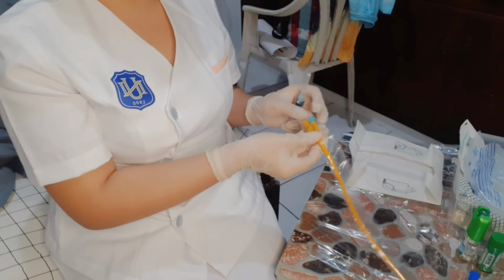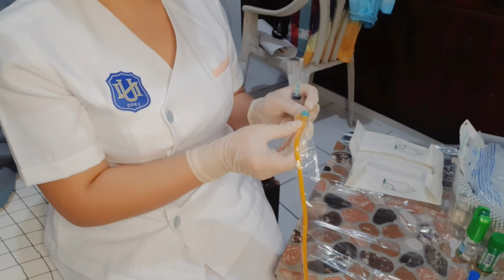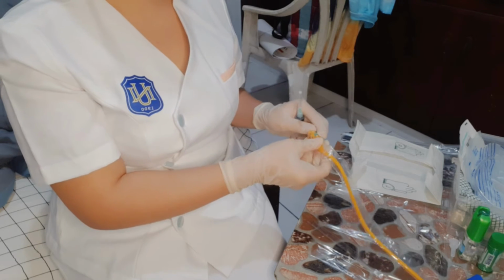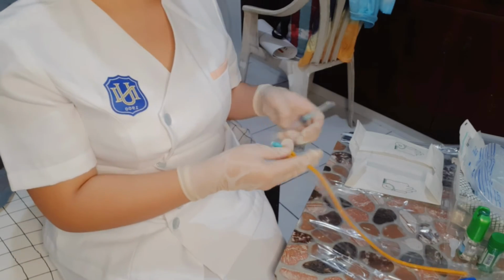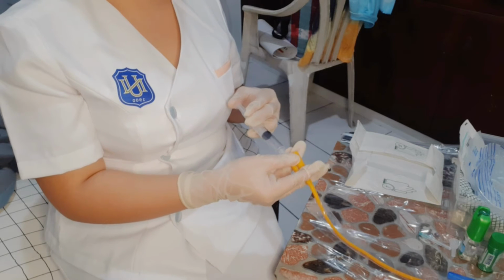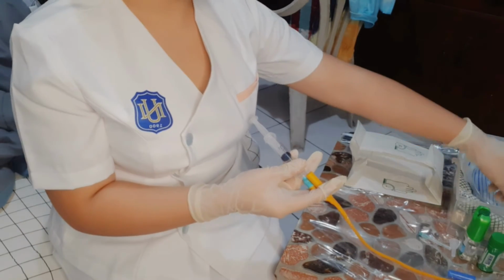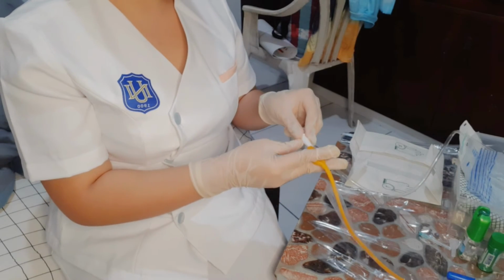So I will open it first. So the rationale of that, if the balloon malfunctions, it is important to replace it prior to use. So I have here the 10 ml syringe in order to inflate the hub and test the balloon. So of course, I have it here, the urine bag. I will place it here.